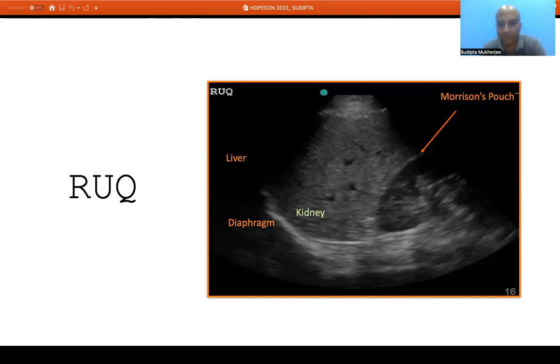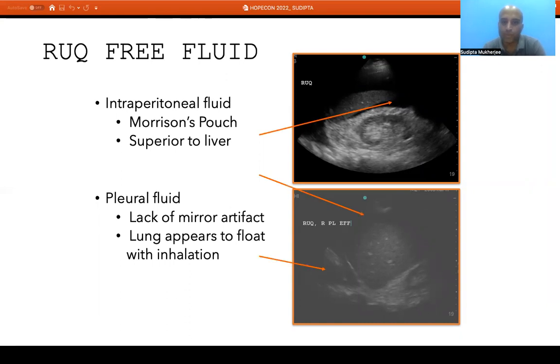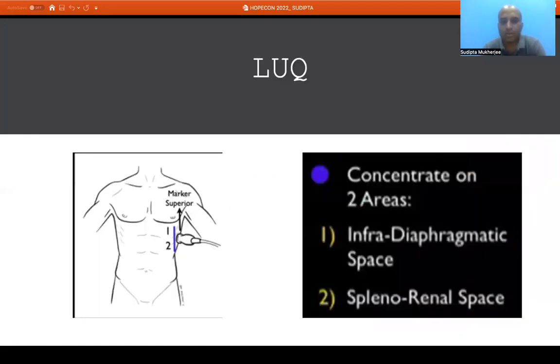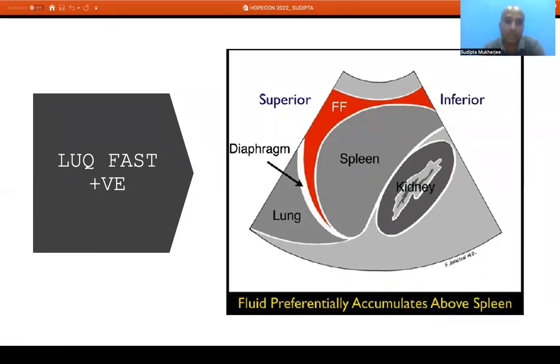In a real-time right upper quadrant image we can see the liver, the kidney, and the potential space of Morrison's pouch — the most dependent part where even small amounts of fluid collect. Any free fluid here is described as right upper quadrant FAST positive. On the left side, we look at the infradiaphragmatic space and the splenorenal space — fluid mostly collects surrounding the spleen, so the subdiaphragmatic area is very important. Any free fluid is described as left upper quadrant FAST positive.